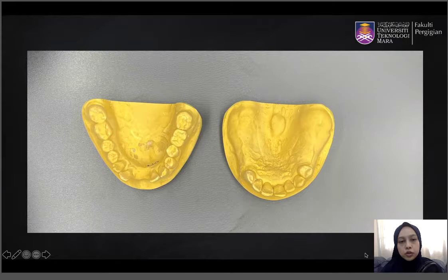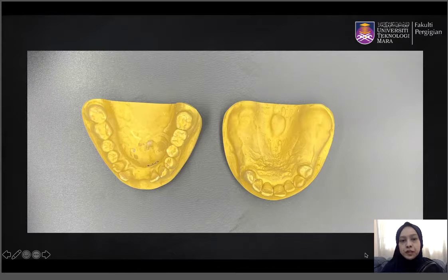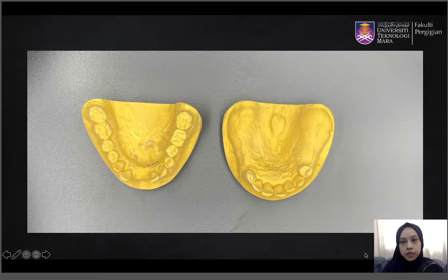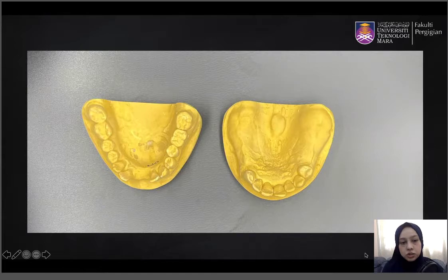First, you have to start by examining the cast that you are going to survey. This is what you have — the maxillary and mandibular cast. Examine the cast from the occlusal view so you can see if there are any particular undercuts or anatomical features that you want to pay attention to.